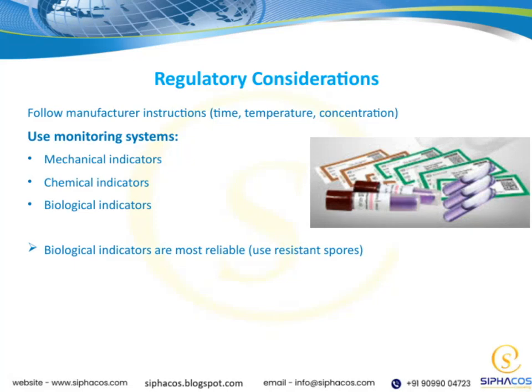Now, let's talk about some important regulatory considerations. First and foremost, always follow the manufacturer's instructions carefully, paying close attention to the recommended time, temperature, and concentration settings. These guidelines are designed to ensure effective sterilization and safety. Next, it's crucial to use monitoring systems throughout the process.